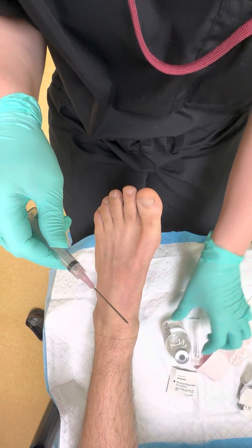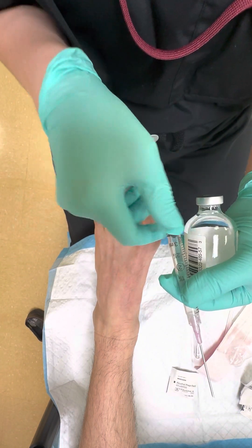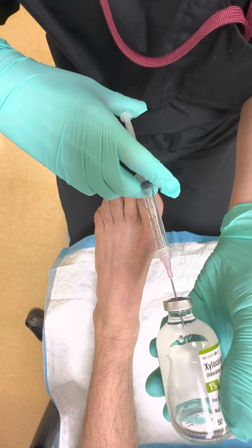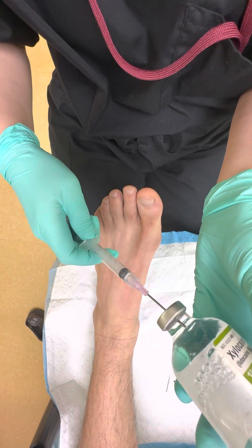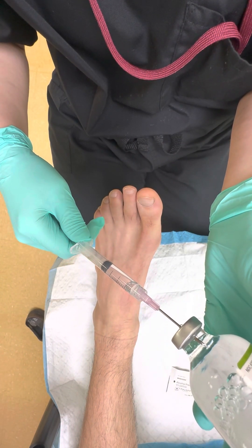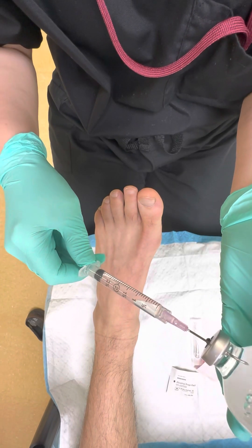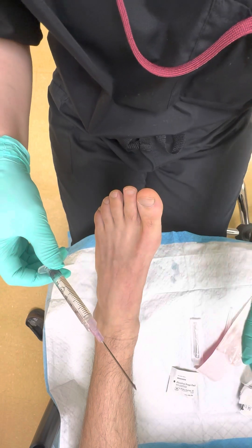Draw back on the syringe first — about 4ml. Make sure the needle is in the local, push the air in, and then create a pressure gradient so the local flows into the syringe. Make sure there are no bubbles, push back a little, confirm you have 4ml. When you're happy with it, take the needle out.